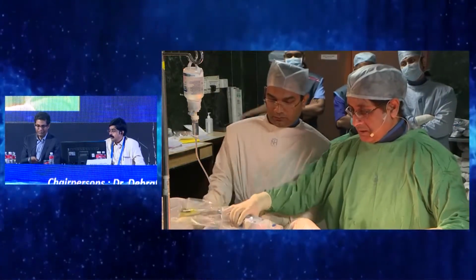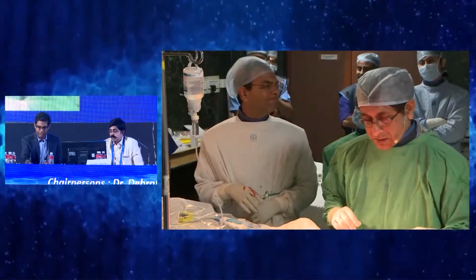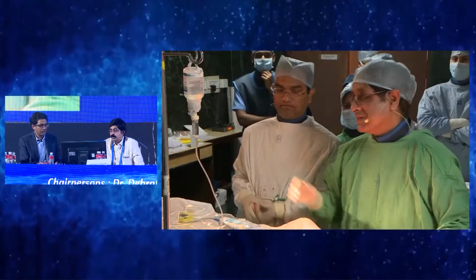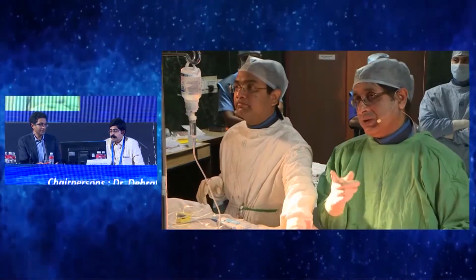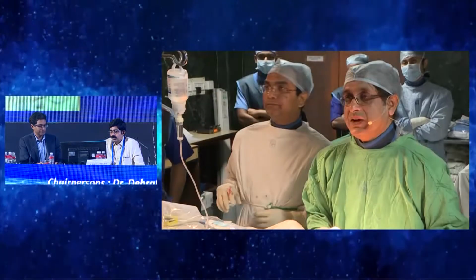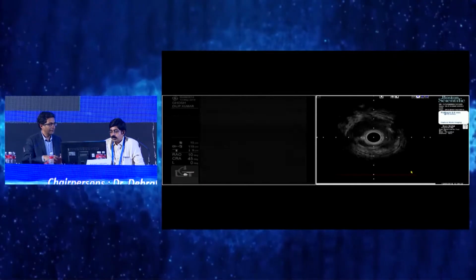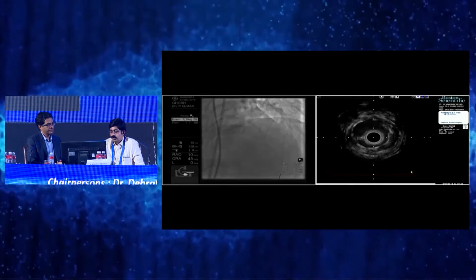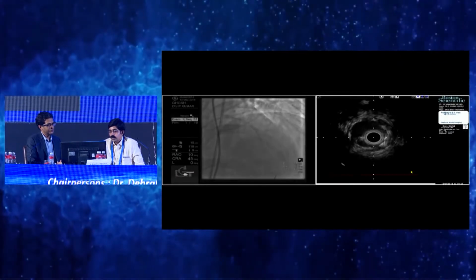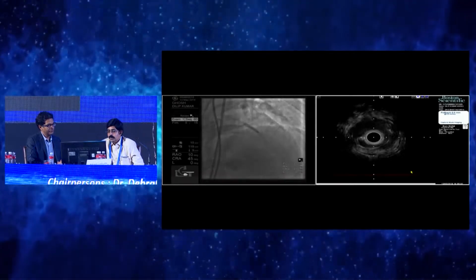Okay. Yeah, we have 1 minute. Are you with us, Ramesh? Yeah, we are back with you for 1 minute if you don't mind. Okay, just show them the final angiogram. So we have taken a 3.5 by 48 millimeter stent, and we have deployed it like that. Okay, show the final after post dilatation, and if we have time, we are going to show you the IVUS. Okay, so just show the final, please.